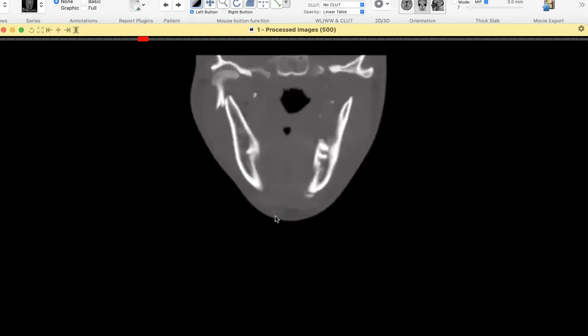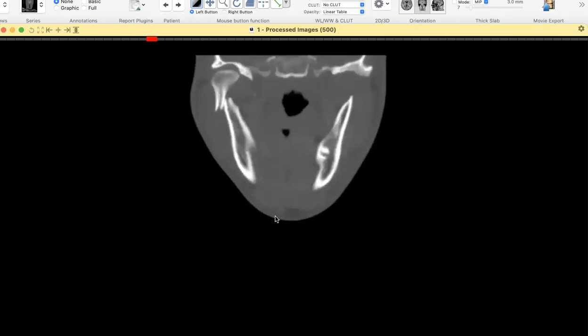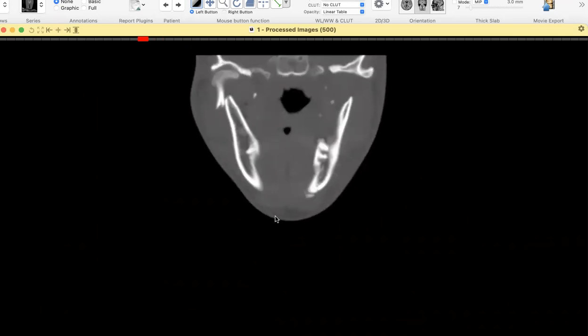Any other ring structures, any other ring fracture that you can tell me? Generally speaking, orbit, or any rounded structure, obturator, pelvis, ankle joint, hand, anywhere. What is the name of the fracture which involves the ankle joint and also involves the proximal fibula? Maisonneuve fracture. Yeah, that is correct.